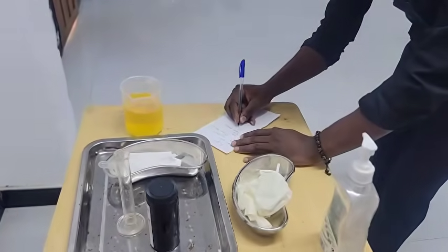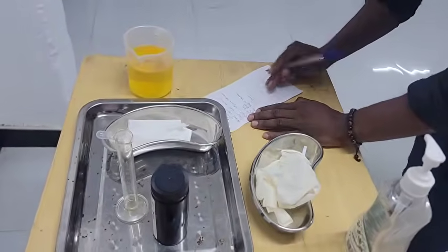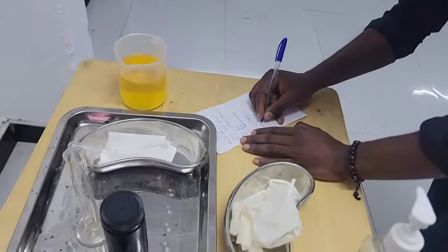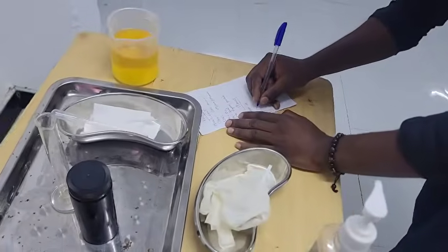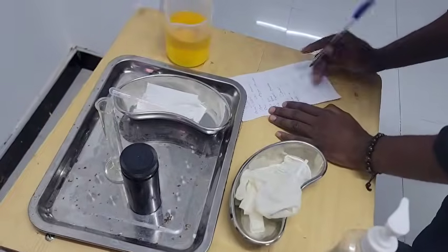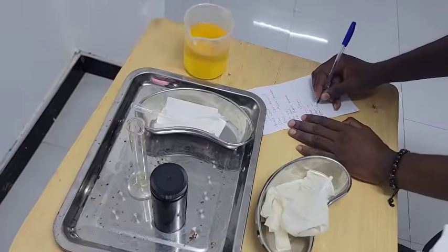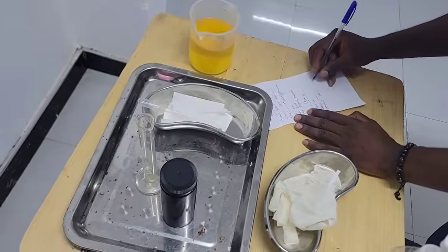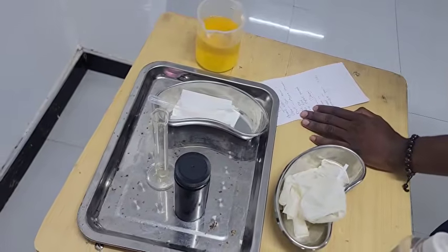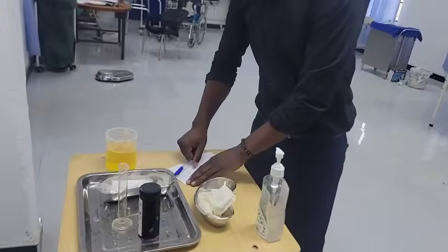And then for the chemical properties, you are going to say leukocytes positive, glucose negative, specific gravity which is 1.020 until you finish everything there, because remember you have to document. You need to write down your findings.